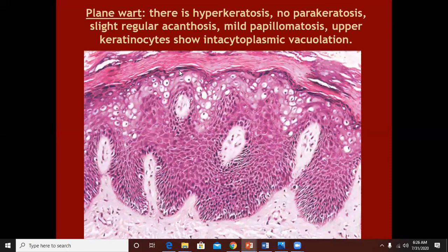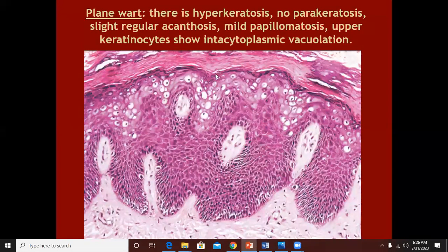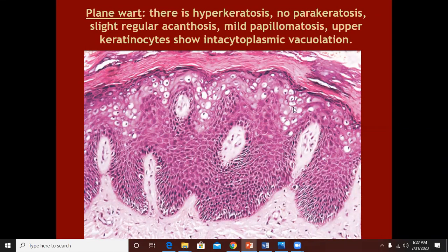Plain warts are not very hyperkeratotic — they have a flat top. There will be hyperkeratosis but not as much as we have seen in common warts or plantar warts. There will be hypergranulosis, but what you see more commonly is intracytoplasmic vacuolation and halo-like cells in the stratum granulosum, rather than seeing viral inclusion bodies.